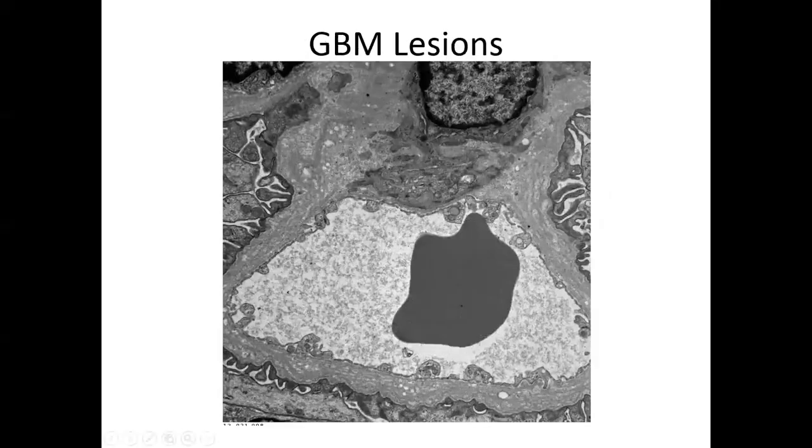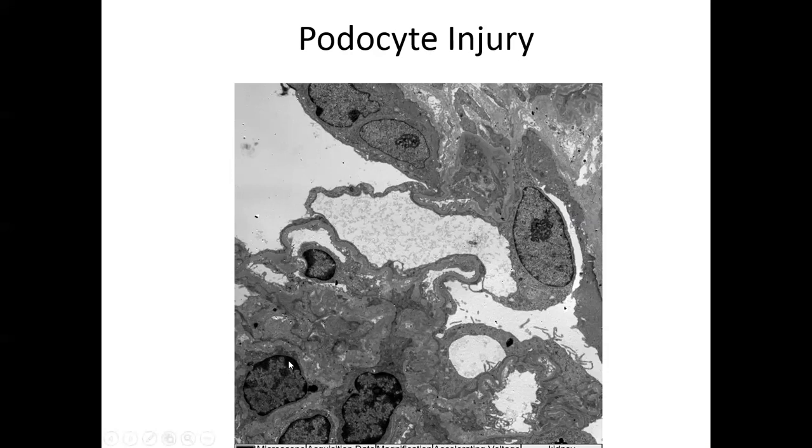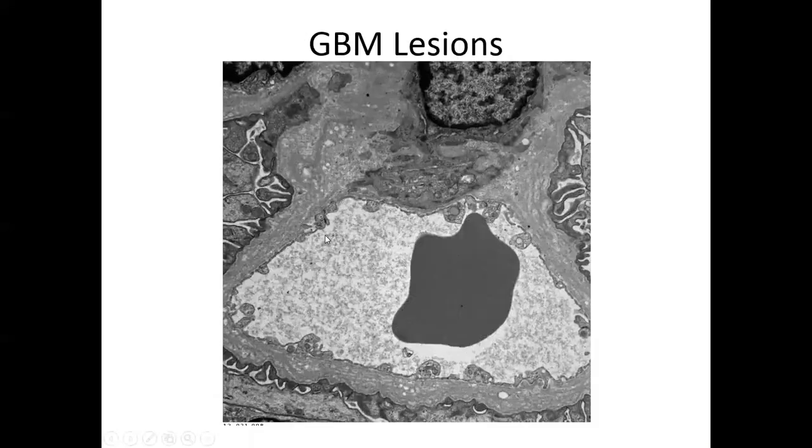And then as Dr. Clark presented at ACVP, you can have abnormalities in your glomerular basement membrane. So this particular dog is a very small breed dog, and you have all these different laminations of your glomerular basement membrane. It is not just a dense, normal, uniform, characteristic GBM. It has multi-laminations, and these dogs are proteinuric, and they don't have evidence of underlying immune complex deposition.